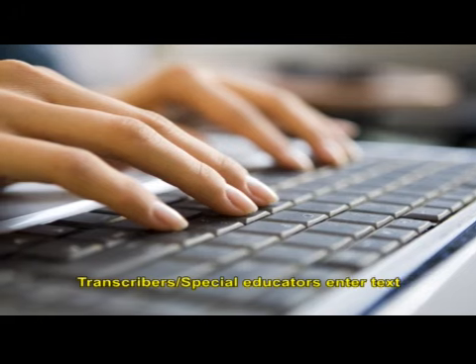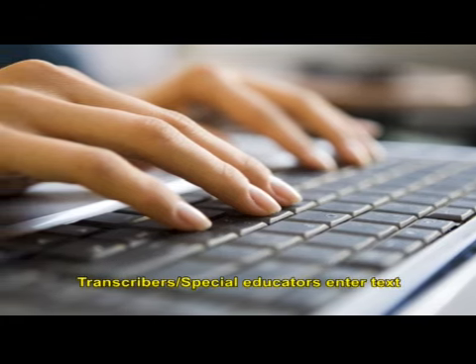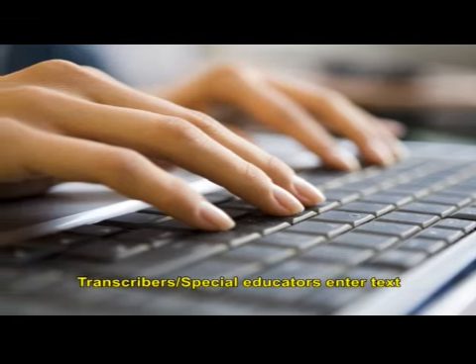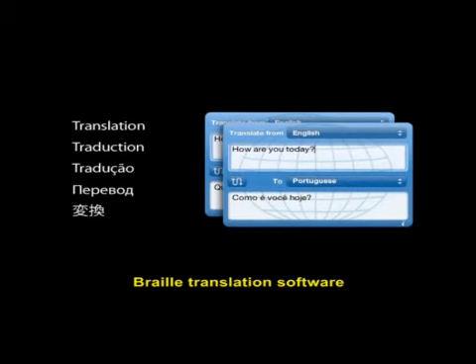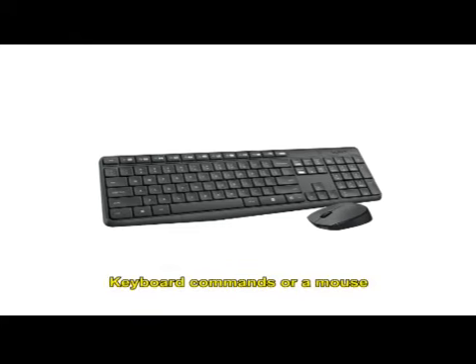Transcribers or special educators enter text into a standard word processing application, edit it, and then save it as an electronic file. This file is then opened in the Braille translation software. The translation software can be used with either keyboard commands or a mouse.